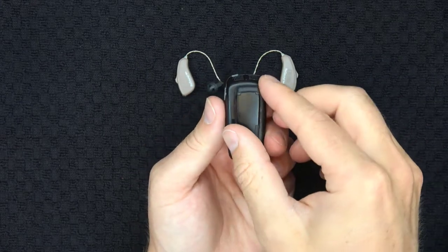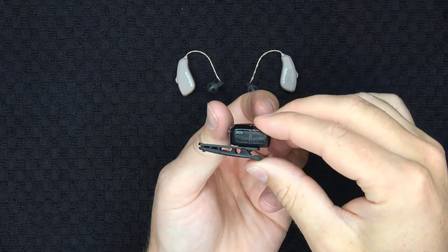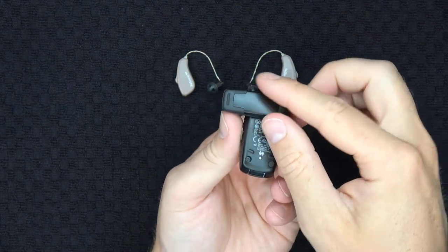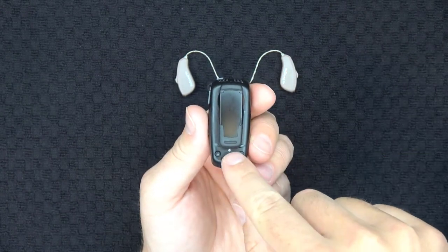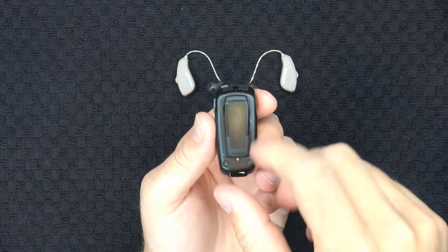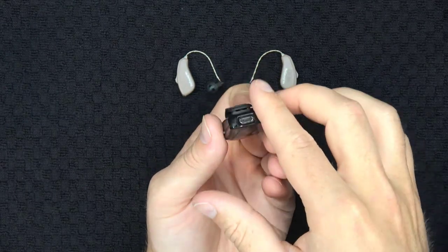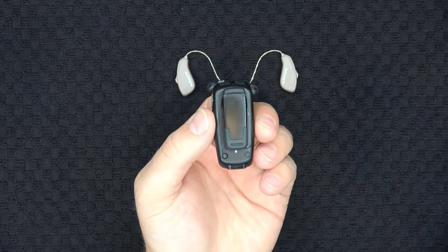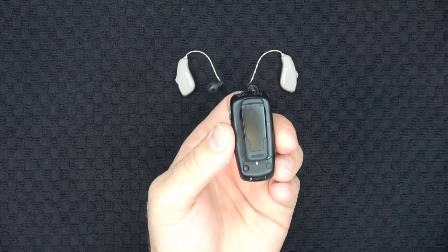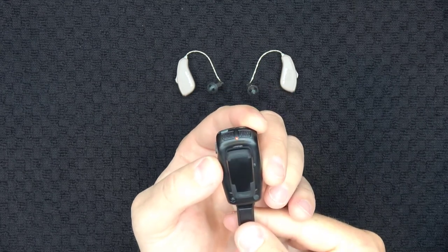On the back of the Micromic, you will find the adjustable clip, which swivels side to side, allowing you to clip the Micromic onto a shirt, blouse, or onto the lanyards that come with the device. Directly below the clip, there is a very small white button called the pairing button. On the bottom of the Micromic, you'll see the micro USB charging port. Before pairing the Micromic with your hearing aids, it's recommended that you fully charge the Micromic with the provided micro USB power cable.